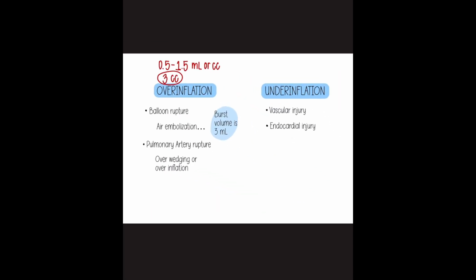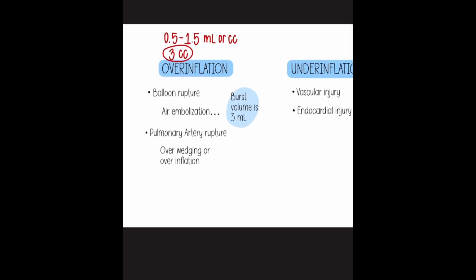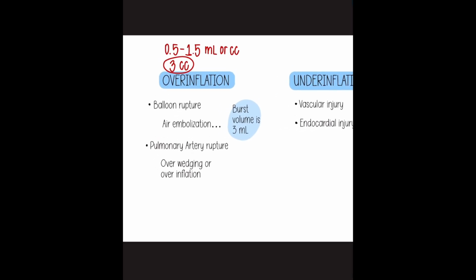So when you're prepping this, you're going to prep it outside of the body and you're going to check the integrity of the balloon under saline. If it bubbles up when you inject some of that air, then you know it has a leak and you need to change it out. If it doesn't inflate at all, then it's already busted.